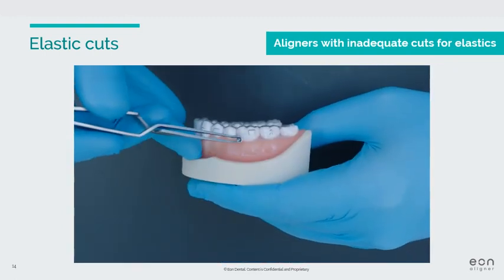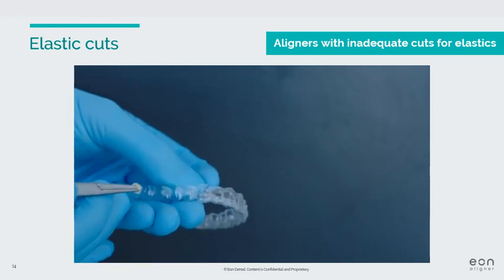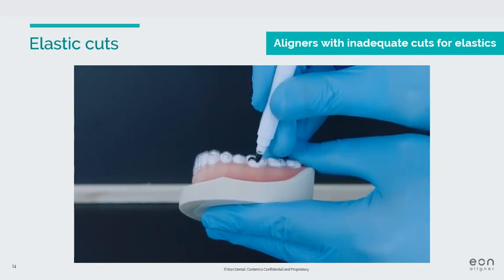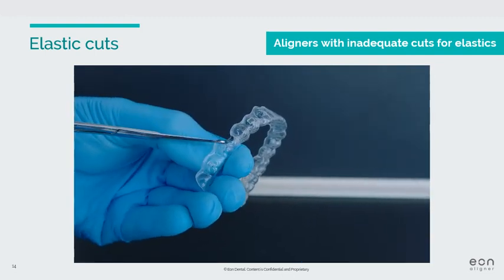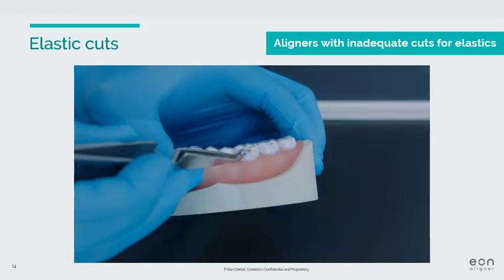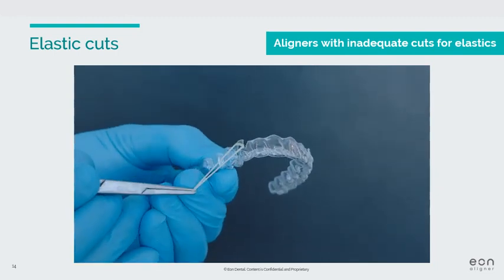Another scenario you may encounter is when cutouts are present but are too small in size to fit the buttons. You may also encounter a precision cut that is shallow or not retentive enough for the elastics to catch onto. In this case, there is no need to request a replacement aligner from Eon. You can simply adjust the size of the cuts on the aligner. For example, in this case, you can mark the shape and size of the cutout and proceed with cutting using a scissor or blade. Notice how the button is fitting properly in place now. For the precision cut too, you can use a scissor or blade to increase the size of the cut and try the elastics again. Notice how it resulted in better attachment of the elastic now.